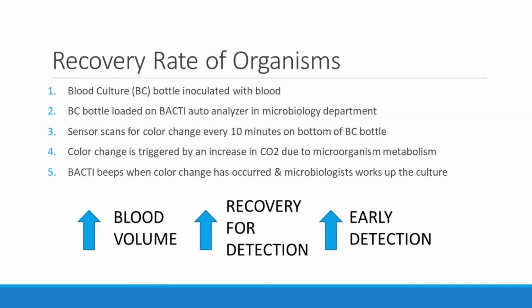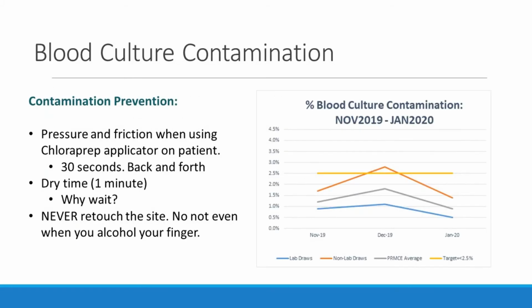And this is just a reminder, if you do need to collect a blood culture, obviously it's very important to not contaminate it. So really use pressure and friction when you're using that ChloraPrep applicator on the patient for 30 seconds back and forth. Let it dry, and please never retouch the site. Don't alcohol your finger and retouch. It does cause contamination, which takes, I think it's an additional 24 hours to work up, and we're calling you when it's not a real infection.